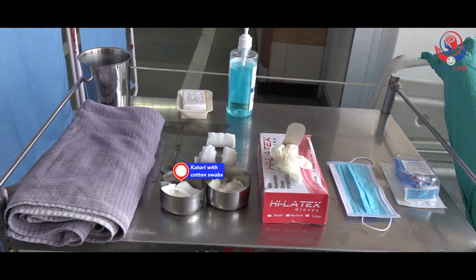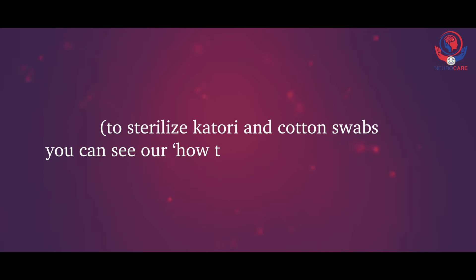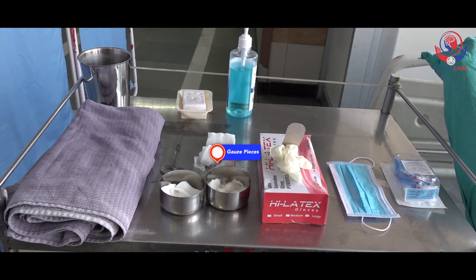A small sterile bowl containing 4-5 sterile cotton swabs and boiled then cooled water or normal saline. To sterilize the bowl and cotton swabs, you can see our 'how to sterilize the articles' video. Some sterile gauze pieces, 4 inches by 4 inches square dressings, in a sterile bowl.